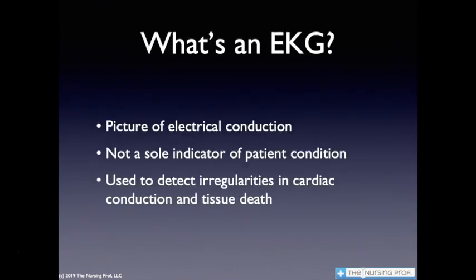What is an EKG? I mean, we're looking at these things, trying to figure out what these things mean. Well, what exactly is an EKG? It's a picture of the electrical conduction, the electrical activity of the heart. It does not tell you about mechanical function. It tells you about electrical function of the heart. Patient may have a sinus rhythm, which is a normal rhythm, and yet be having some severe mechanical problems of the heart. On the other hand, we could have no mechanical function at all and still have an EKG waveform, because the EKG waveform is simply electrical activity in the heart.